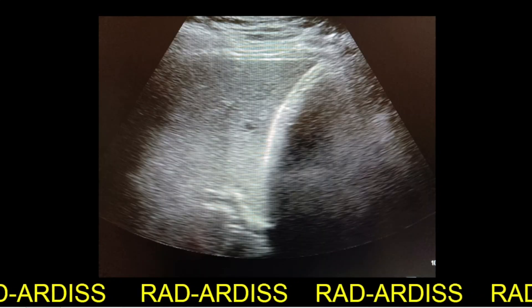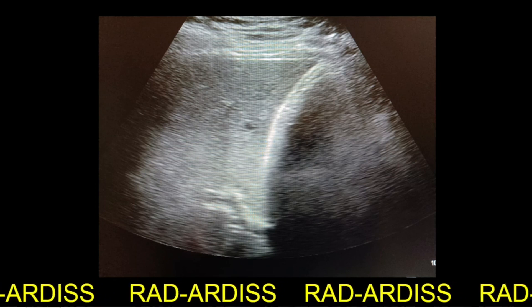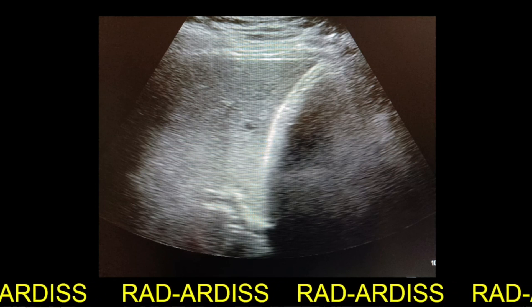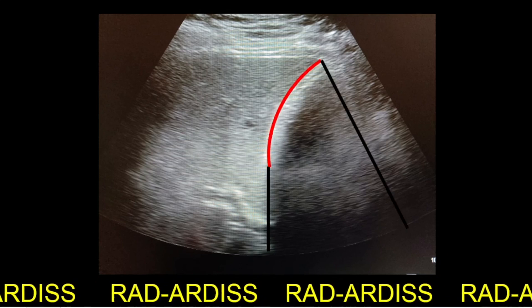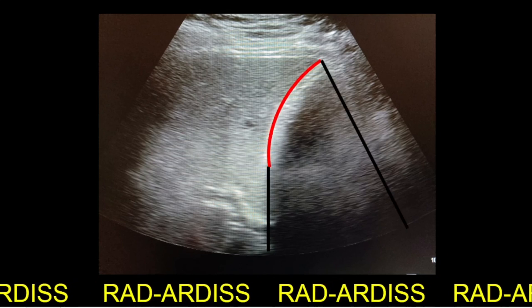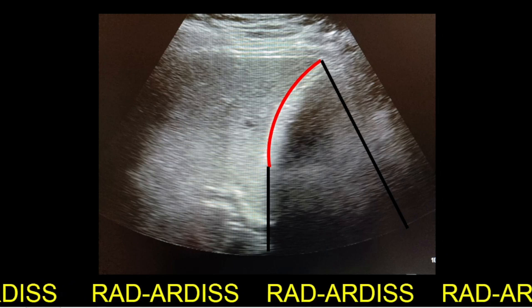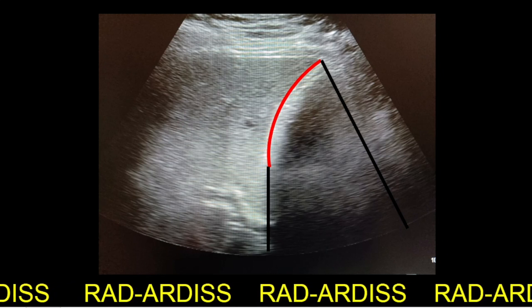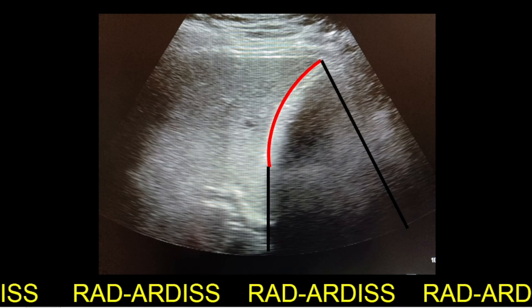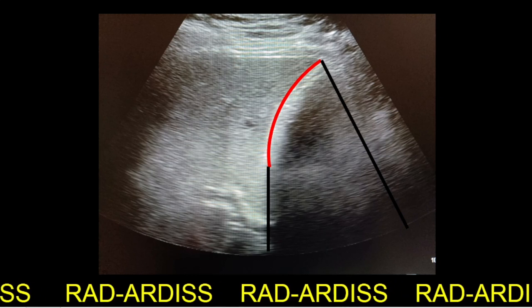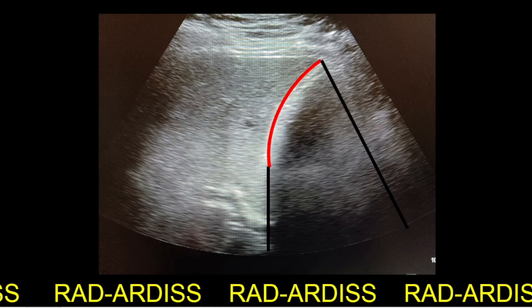Coming back to the original case, what we are actually looking at is the curvilinear echogenic wall of the gallbladder with dense distal acoustic attenuation. So here there is extensive calcification of the gallbladder wall.